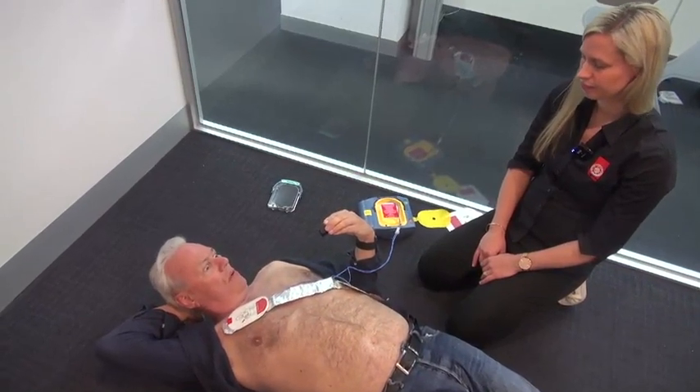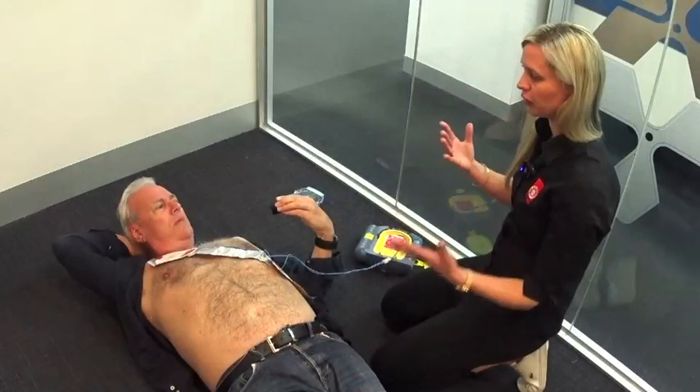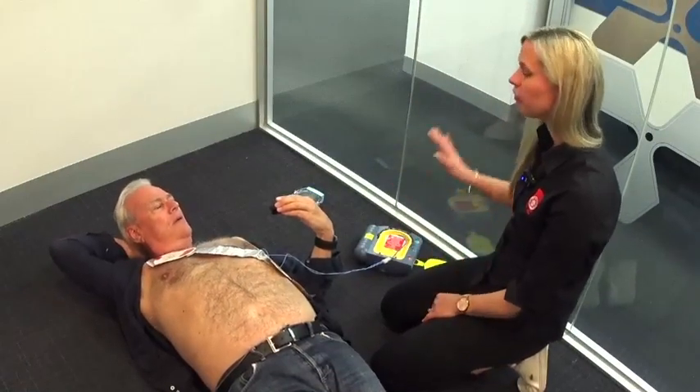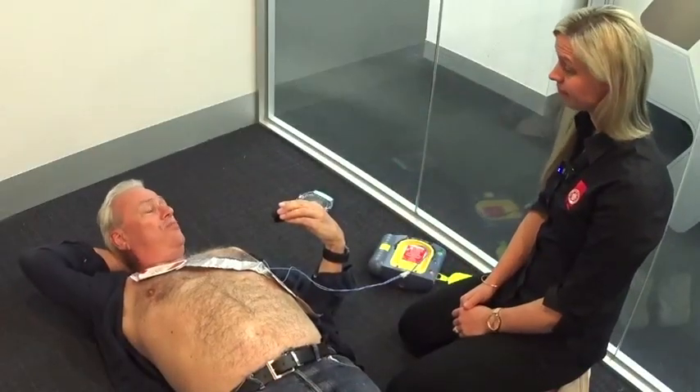Can you understand the reticence, the nervousness that people might have — feeling 'I couldn't possibly do that'? Absolutely — it's always shocking to have something like this and think: what do I do, what if something happens, am I going to hurt someone, even myself? It's just a matter of following the instructions. These are designed for anyone in the general public — you don't have to be a first aider or a paramedic. Keeping that in mind should give you that security.